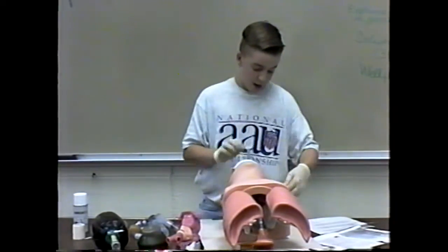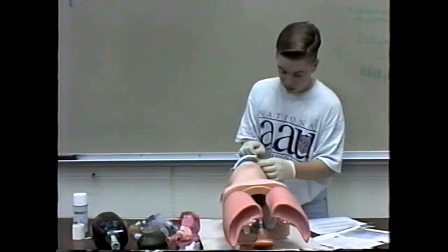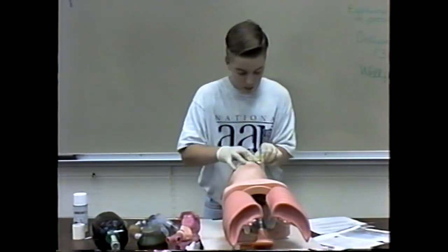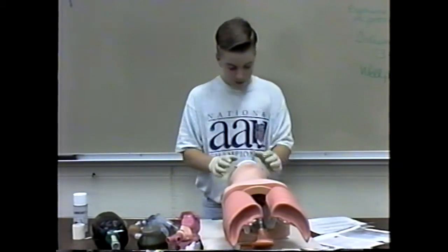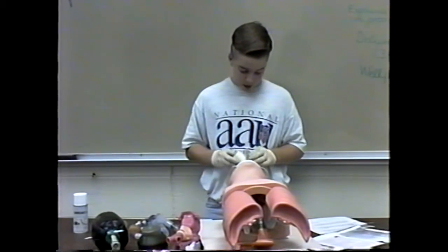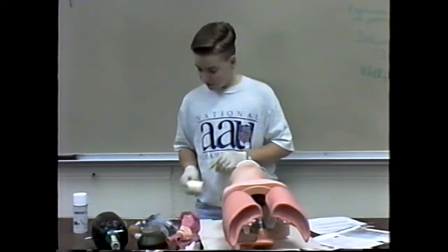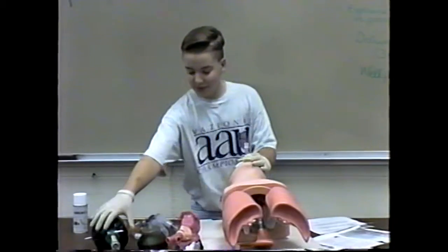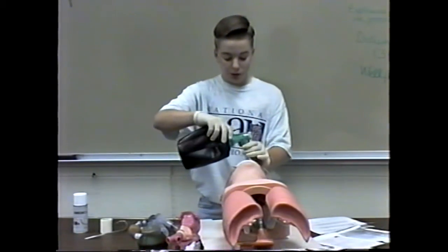That just goes around your neck and comes up on the other side. Then you put a piece of medical tape around it. You put the medical tape around here. And then ventilate again. Make sure it's still in there. Also so it doesn't move.